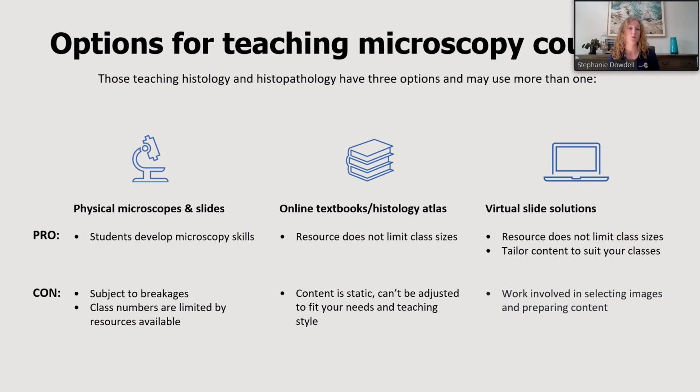Then lastly, we have virtual slide solutions. The advantage of these is that the resources do not limit class sizes. All students, unlimited numbers, can be viewing the same image of the same quality at the same time. And it allows you to tailor your content to suit your classes. The disadvantage is that there is some work involved in selecting images and preparing content.